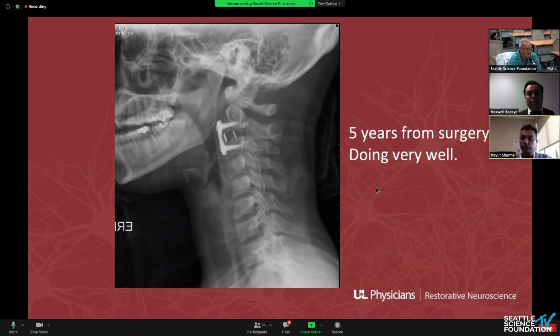Dysphagia, swallowing difficulty is the biggest risk. The second biggest risk is that the plate pivots around C3 because of screw fixation. So these are self-drilling, self-tapping screws. So fixation of those may be a little bit suspect sometimes, but they're near bicortical. The more you're willing to do bicortical screws that are properly drilled and tapped, the better your fixation will be. And getting the C-spine out of kyphosis is a very big deal. So that was very nicely done.